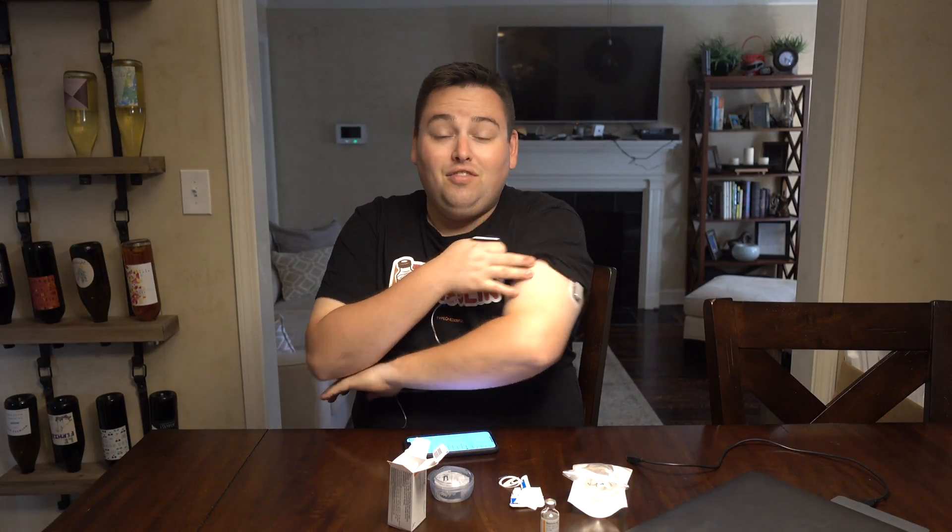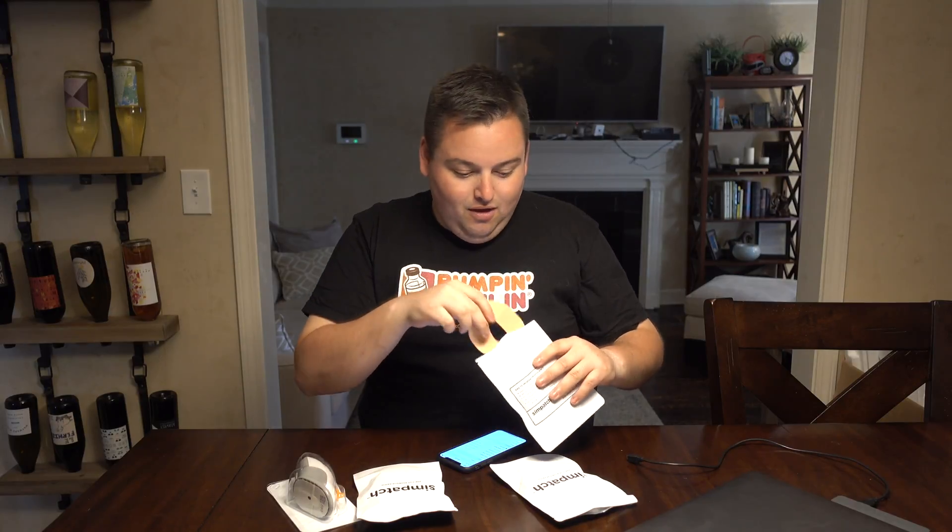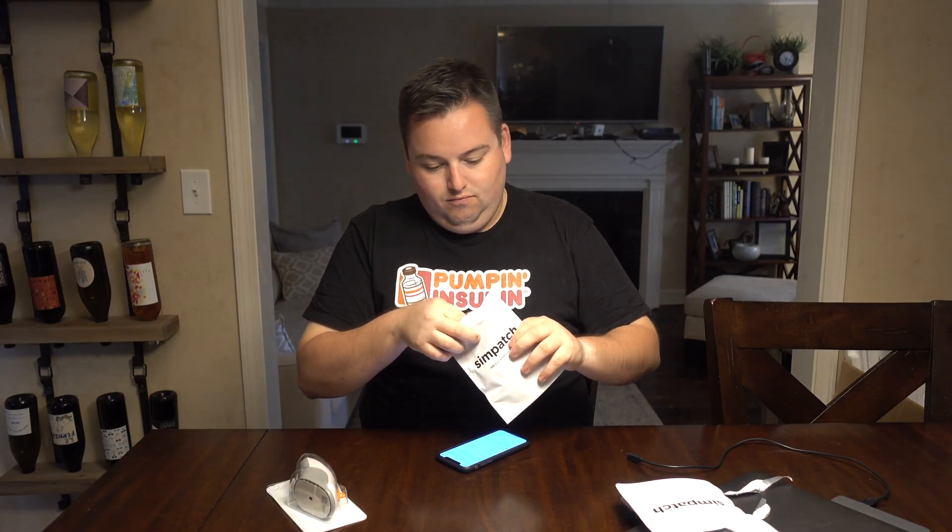Now let's see if we can get the Dexcom put on here. It doesn't look like I can start up the sensor on my pump because it's going to end tomorrow, so I'm going to go ahead and take this one off and put a new one on. I got a new Dexcom G6 sensor. I also wanted to put a skin-tone patch on — I use these the most because I want it to be as close to my skin color as possible, but I also have blue ones and black ones. I'll probably use a black one today.